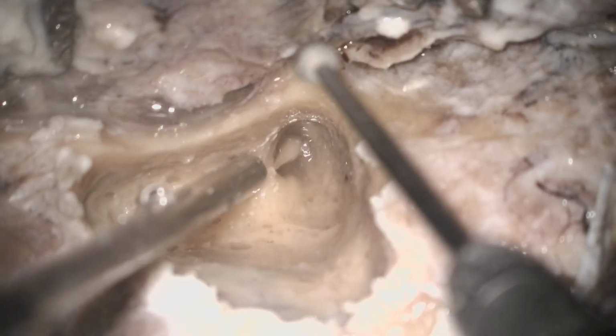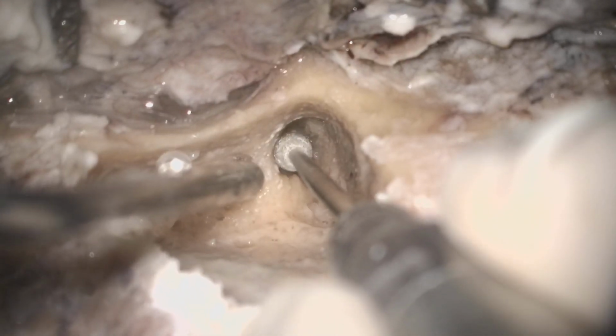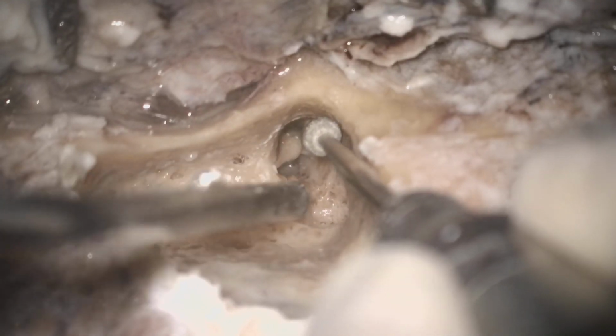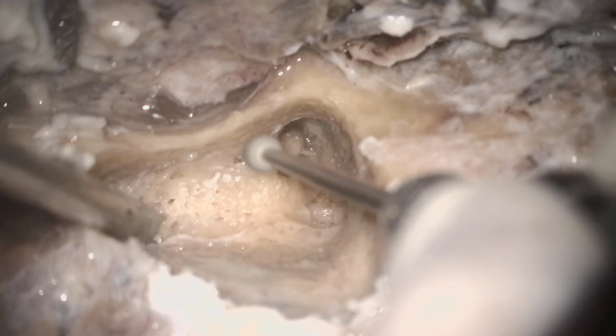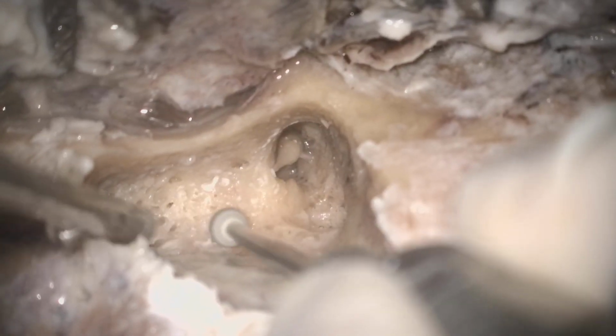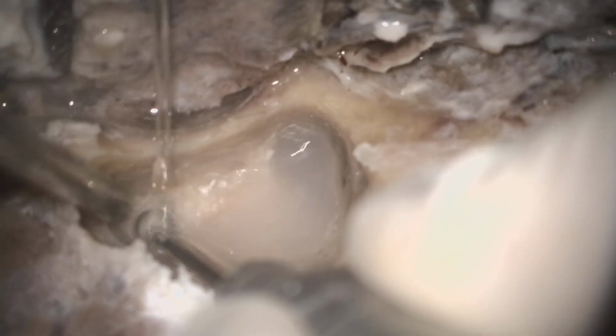Look, this is a thick area of bone and now this is the ridge area. Okay, so this is the bridge, this is the ridge. From the bridge there is air beneath that, and this is a thick bone just below the lateral semicircular canal up to the tip cells or the digastric ridge. This is called the ridge. Okay, so these are the two anatomical landmarks. Here will be the fossa incudis and you will drill from that direction up to the mastoid tip area. So here will be your facial nerve.